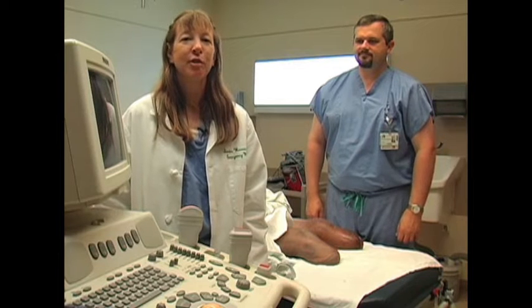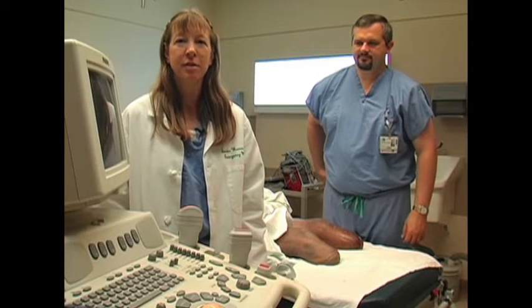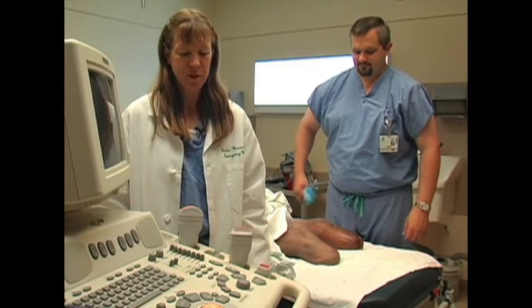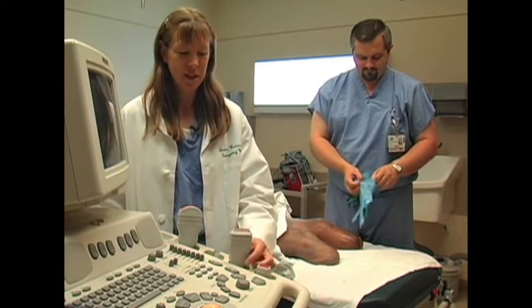Hi, I'm Dr. Sandy Werner, and this is the Access EM video on differentiating an abscess from cellulitis using ultrasound. This is Dr. Dan Haggerty, who will be performing the procedure today.